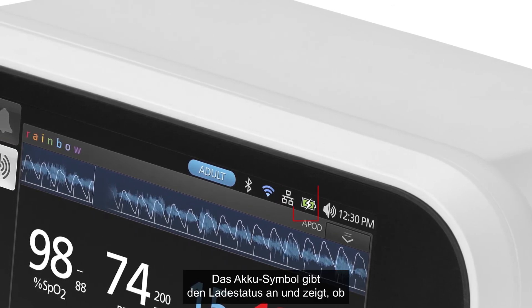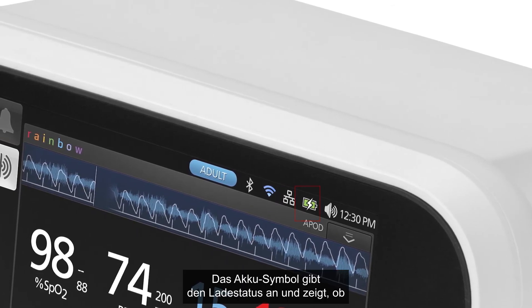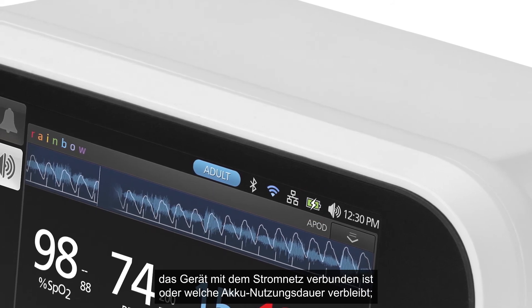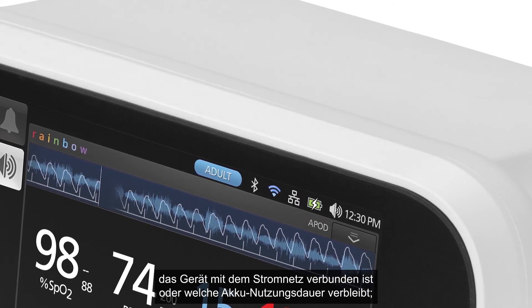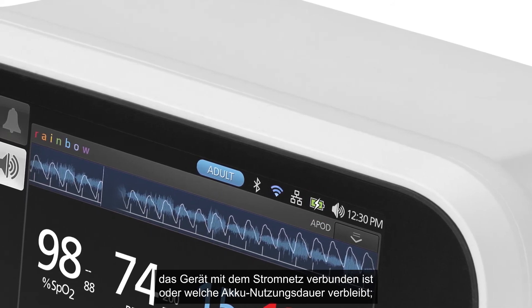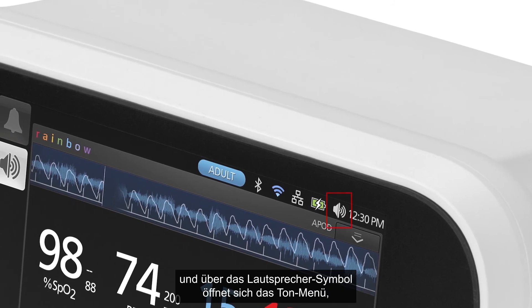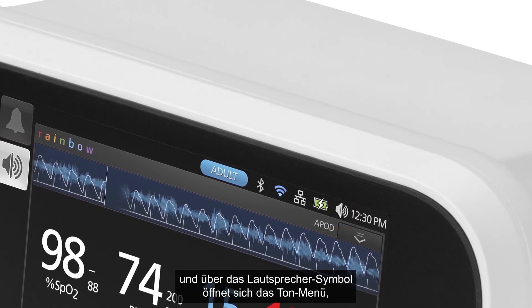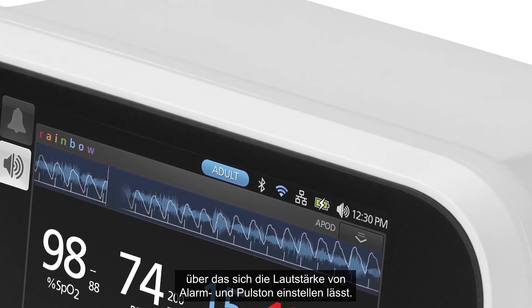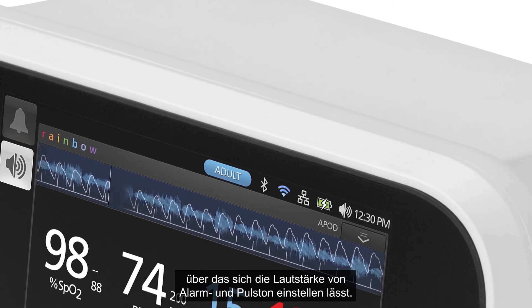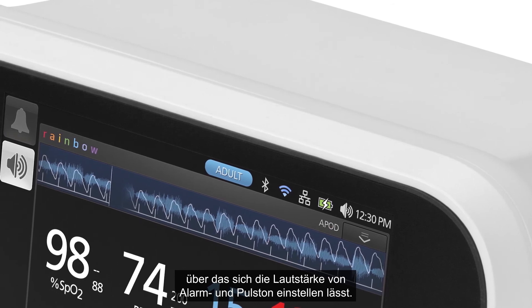The battery icon indicates charging status by showing if AC power is connected or the amount of battery life remaining. The speaker icon provides quick access to the sounds menu, where clinicians can adjust alarm and pulse tone volume.